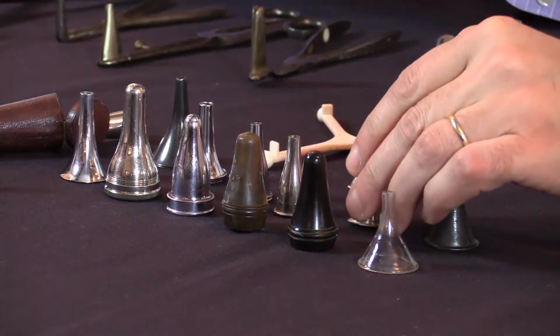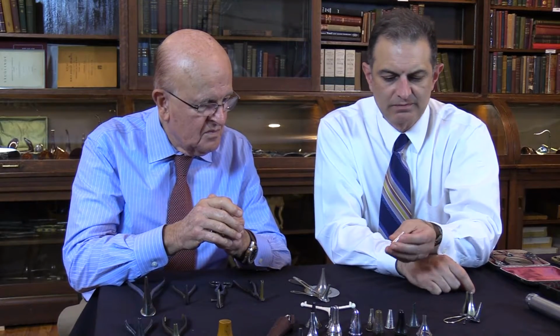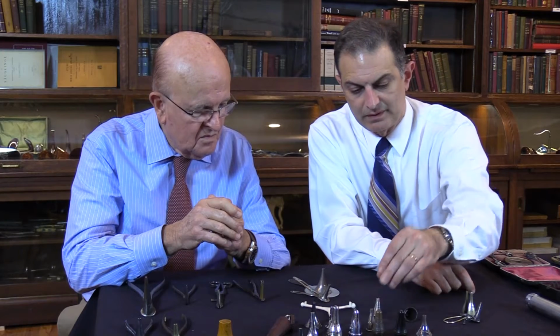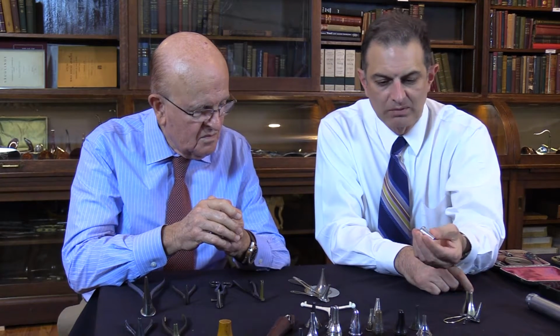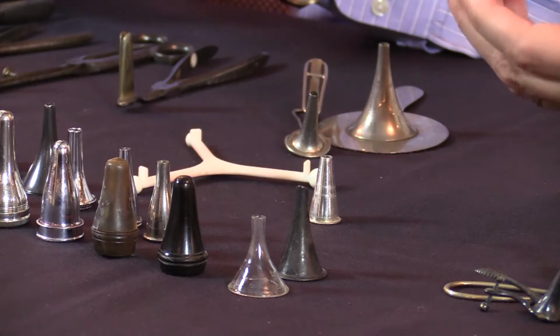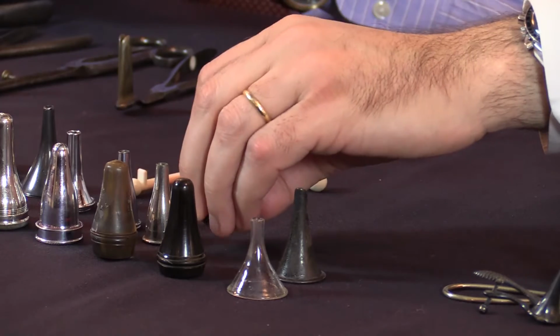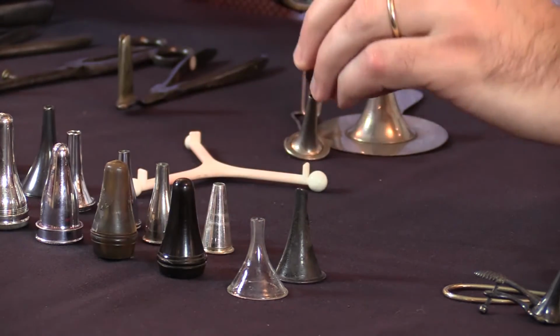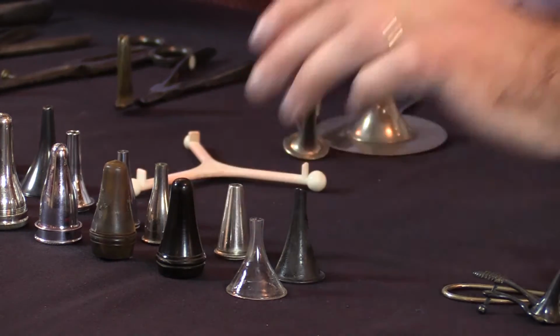Similar to some of the other specula, we've got the Wilde specula, and this grouping is actually made of silver. So it's hard to believe that at one point these specula that we use routinely, that are plastic or inexpensive metals now, were made of silver.